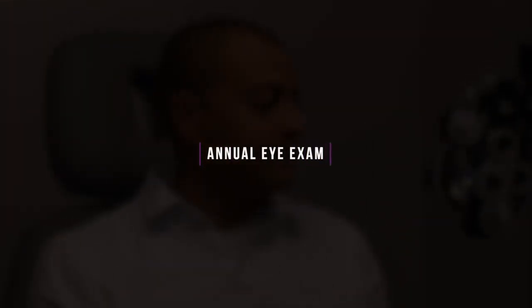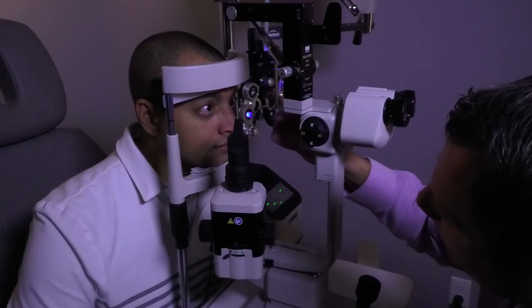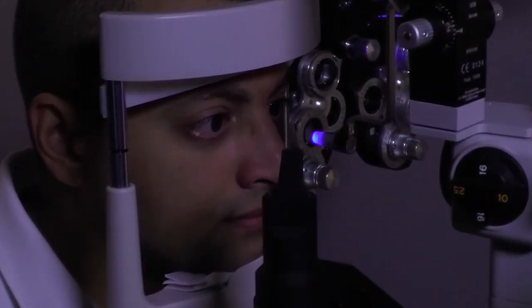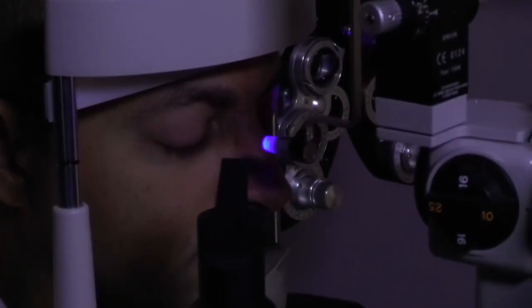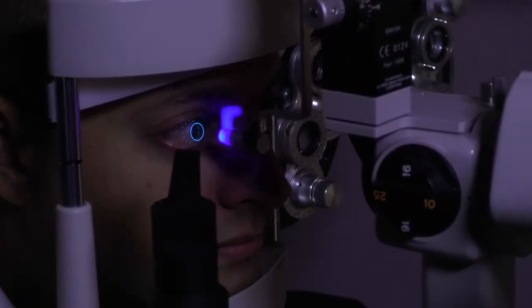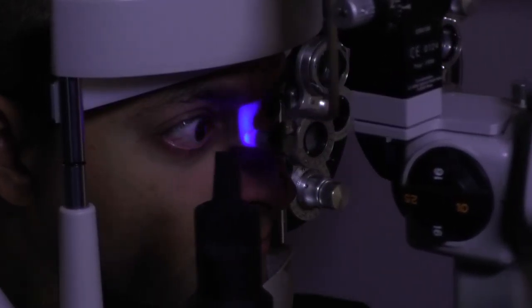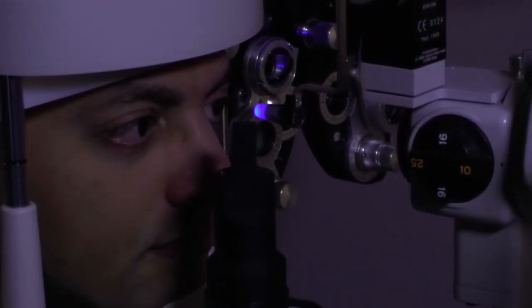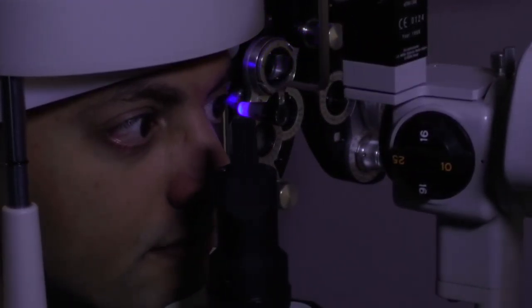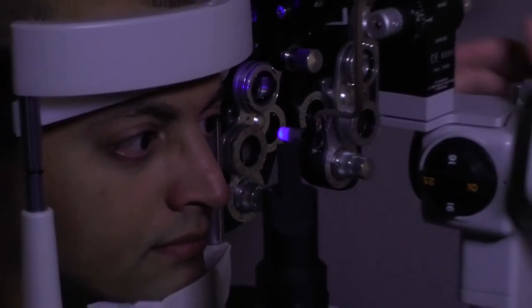We're going to do our yearly eye check here, Mr. B. I'm going to have you blink a few times really good. This part of the probe is going to come really close to your eye and it's going to measure that pressure within the eye — just look straight ahead. Go ahead and blink. Hold it right there. Perfect. I'm going to get your other eye — same thing here. Blink, open your eyes really wide, keep looking straight ahead. Got it, you can sit back.